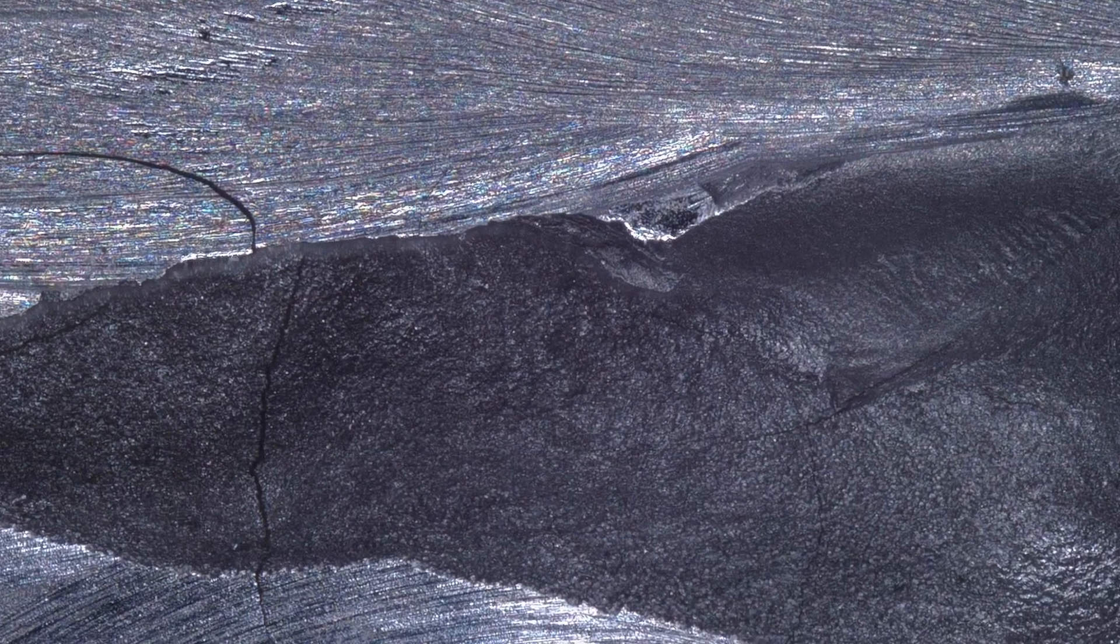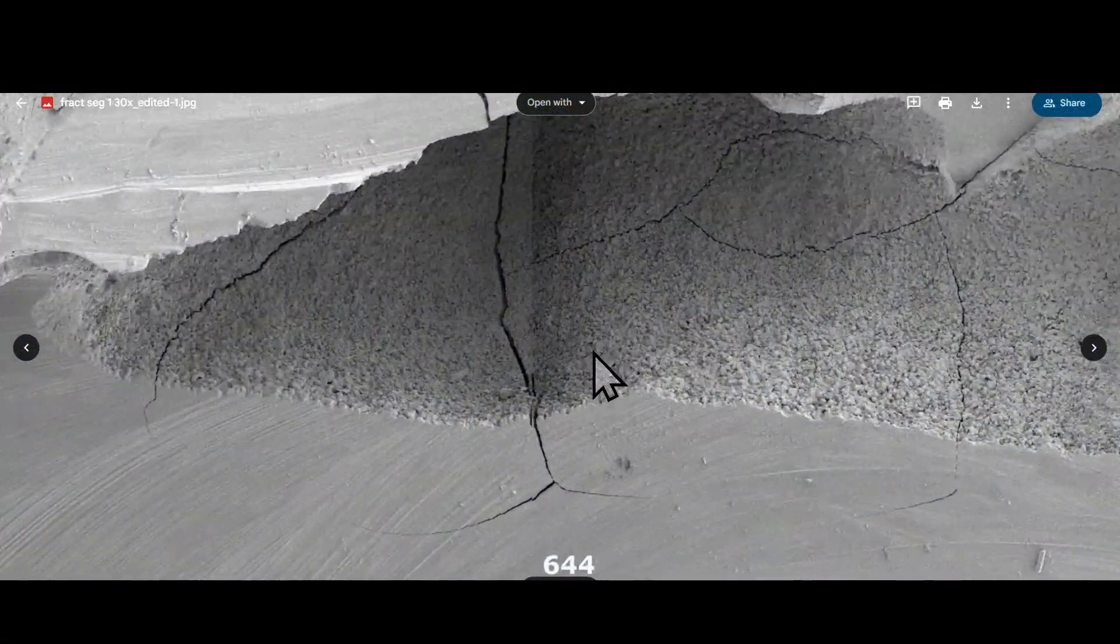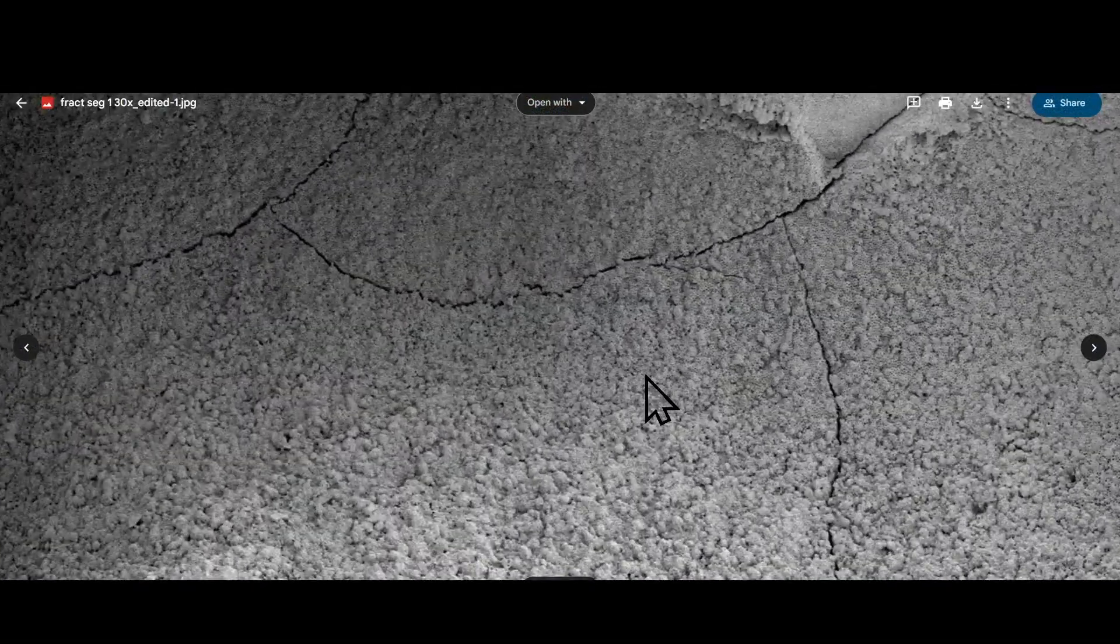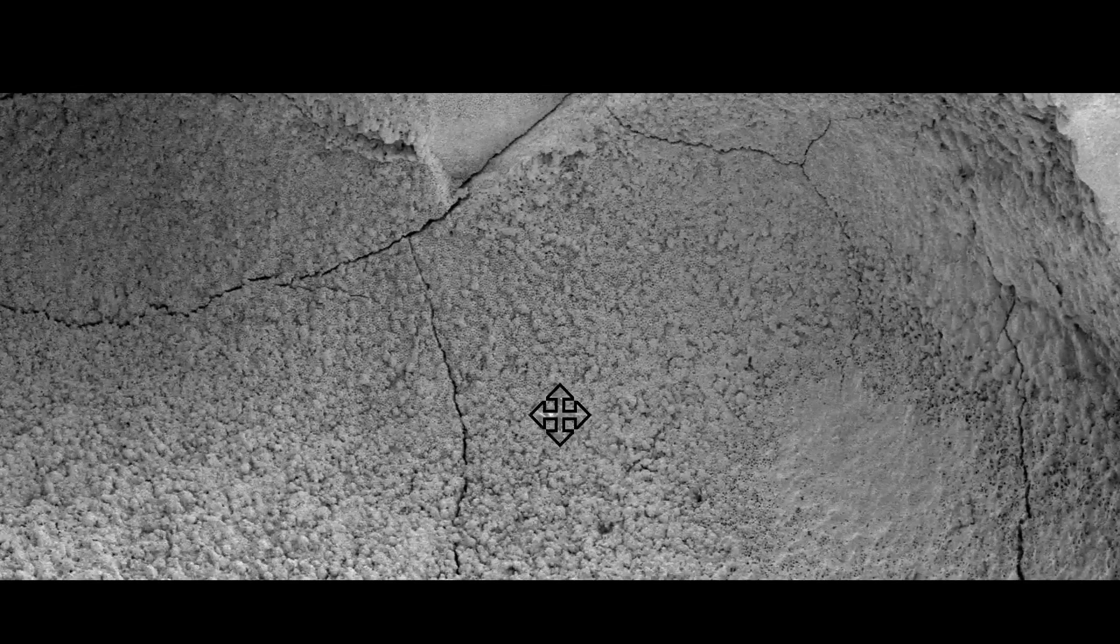So this is the sputter-coated sections. It looks like a very granular surface. There wasn't any visible pulp anywhere in the canal, and when you go into it under low power, it looks like it was just completely clean dentinal tubules.